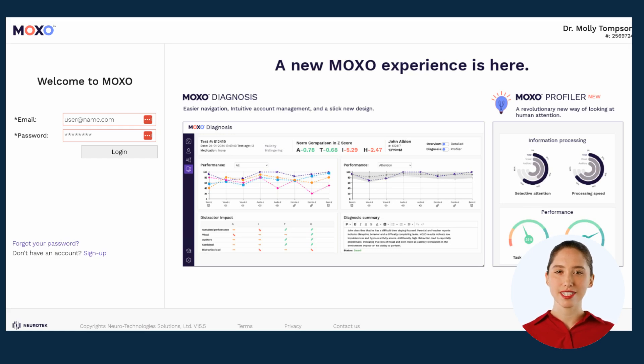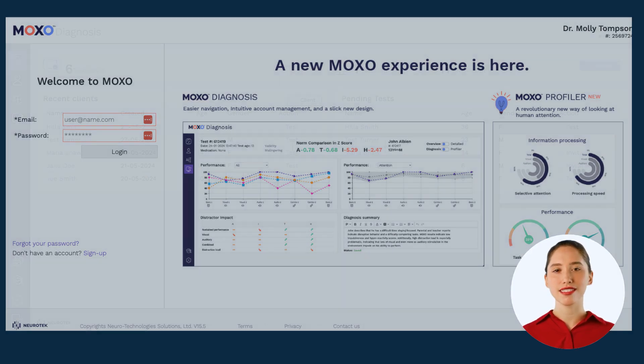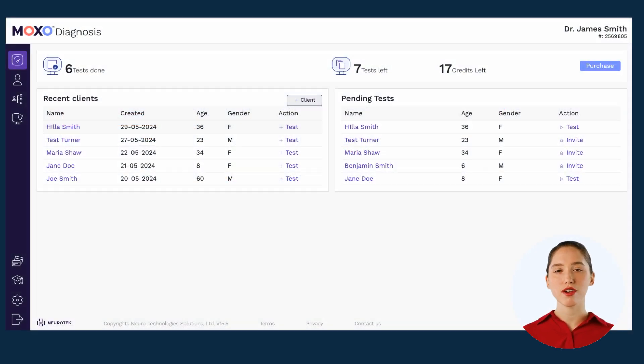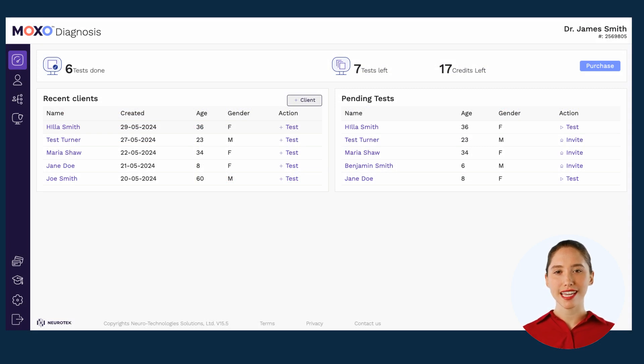Once you log into your account, you'll get to the dashboard or landing page of your Moxo account. You can take most actions and view the most relevant information from this page.